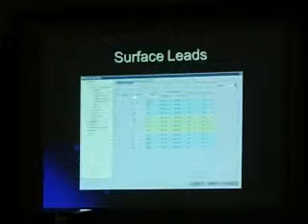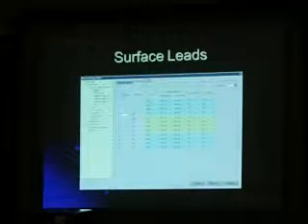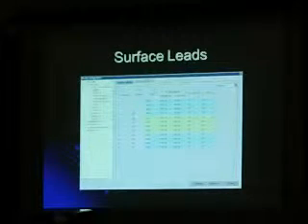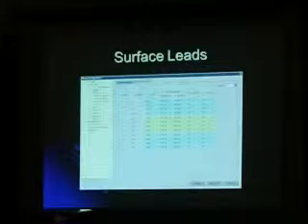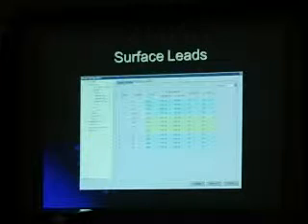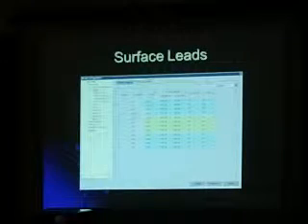So we have our leads 1 through 12. And you notice how our gain settings are all set at 1,000. Now our high pass is set at 0.05. Why is that? Because the P wave and the T wave are very slow coming, and we need to be able to pick that up.